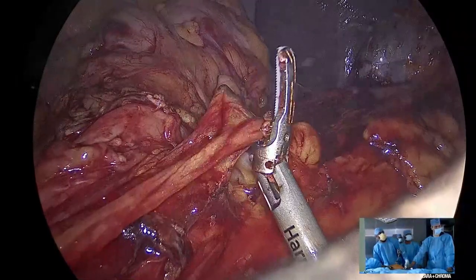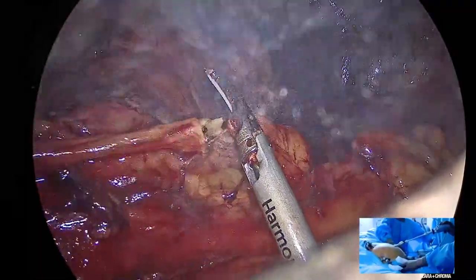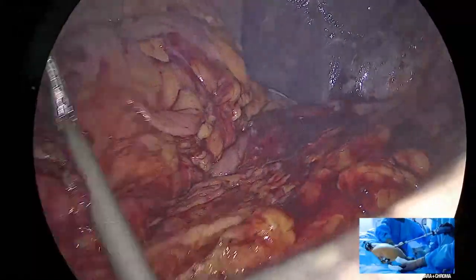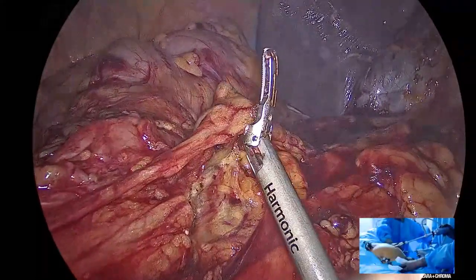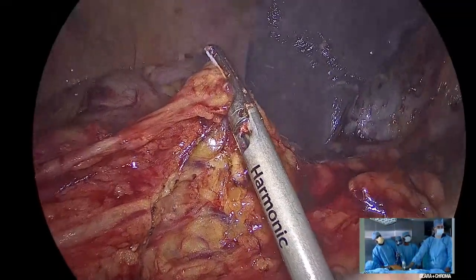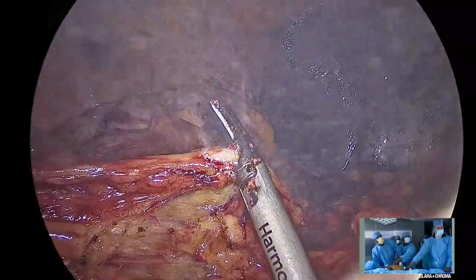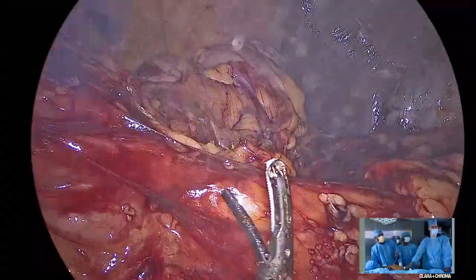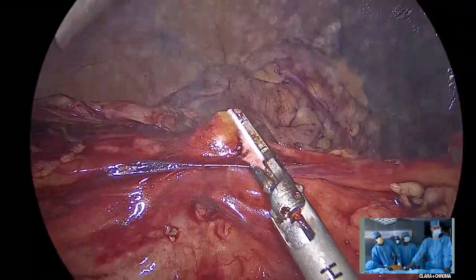So Jameel, I think the adhesion to that anterior abdominal wall is actually helping you. Right. It's a wise thing to keep adhesions which are your friends. Yes. And not treat all adhesions as enemies. Well, the first few adhesions were not really friends. I had to take them down completely. But the one that has taken the pylorus up to the anterior abdominal wall, I entirely agree, that's giving me natural retraction. But earlier, I think you missed the earlier part, Anil. I was not able to see this area at all. So we had to take all of it down.